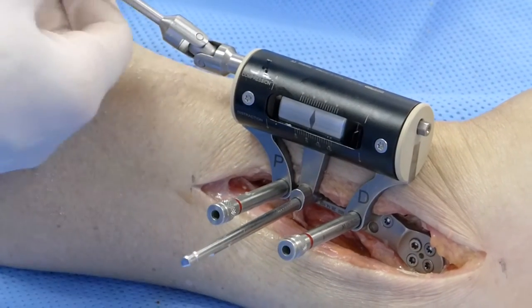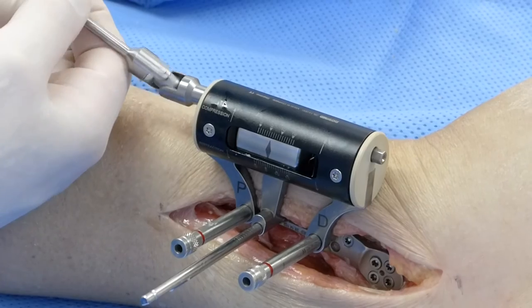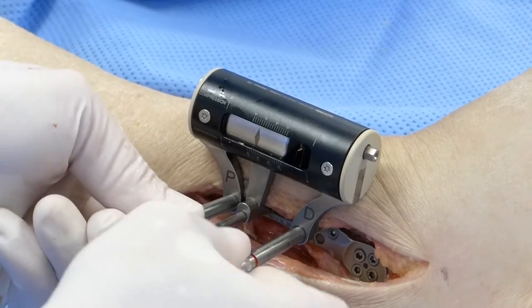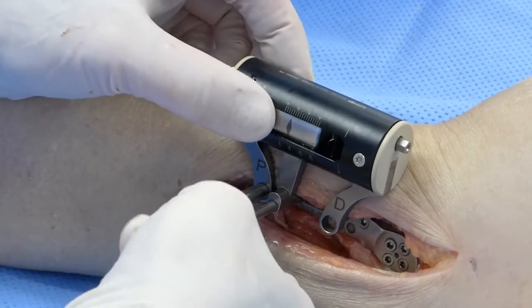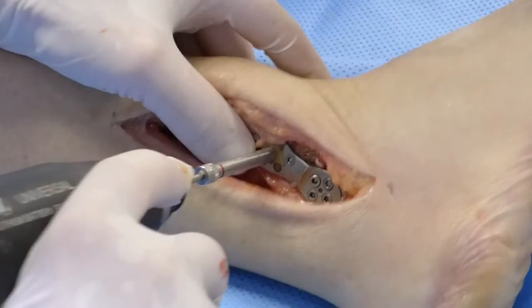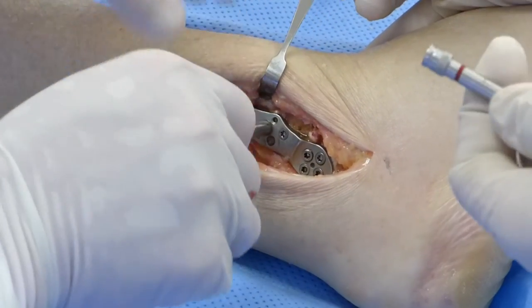Once this has been achieved, the external compression device is released by undoing the side bolt. The final screws can then be introduced using the red drill sleeves and drill bit.